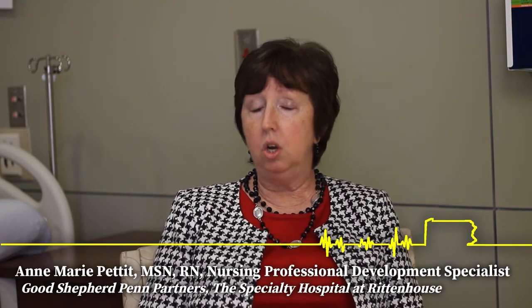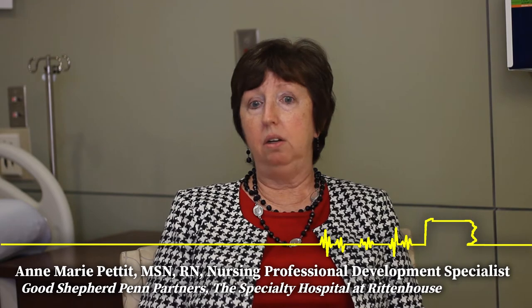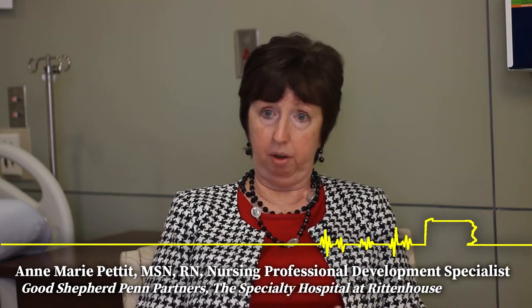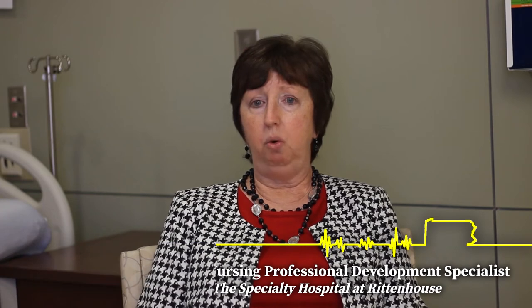So we decided, after some collaboration with the pulmonologist and the respiratory therapist, and looking at the data, looking at a lot of research that's been going on, that we could lower our low limit of SpO2 to 88%.